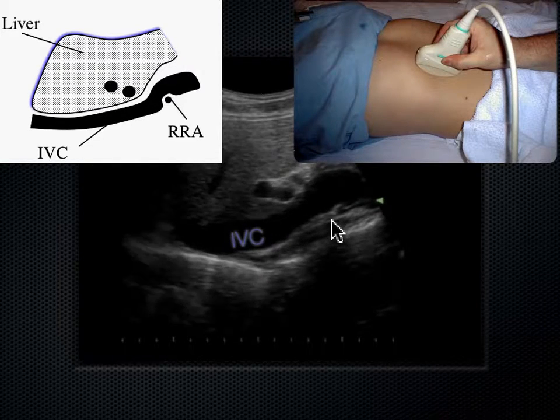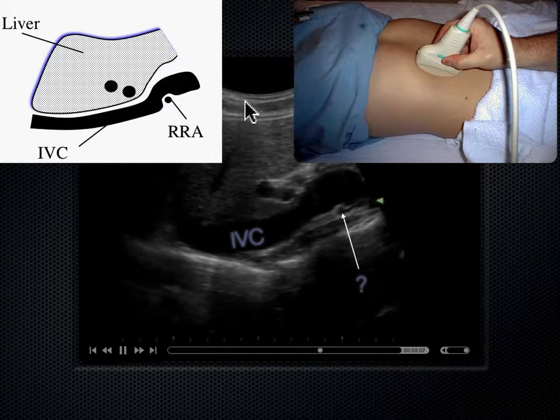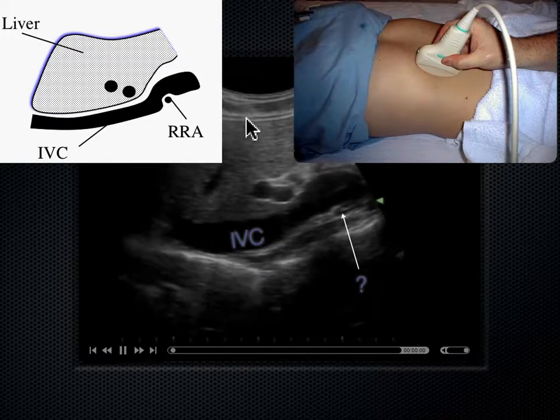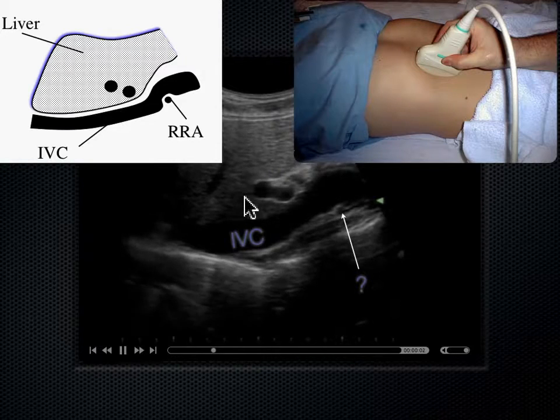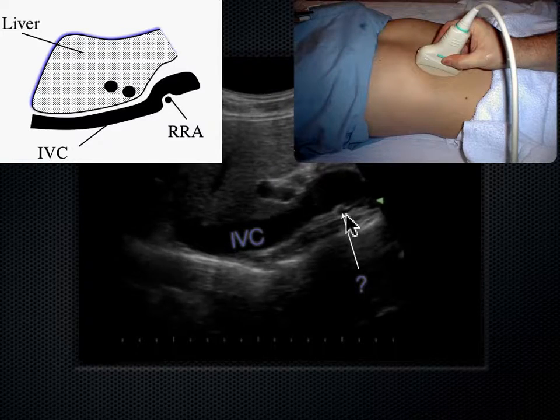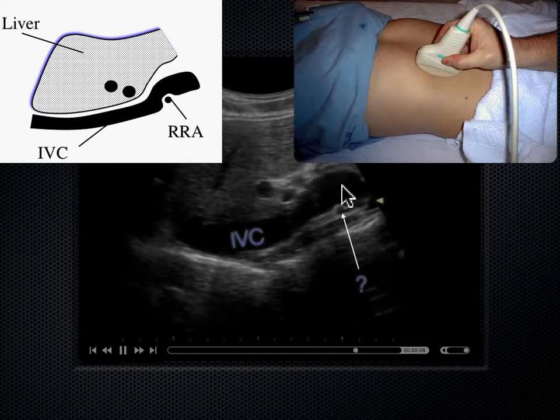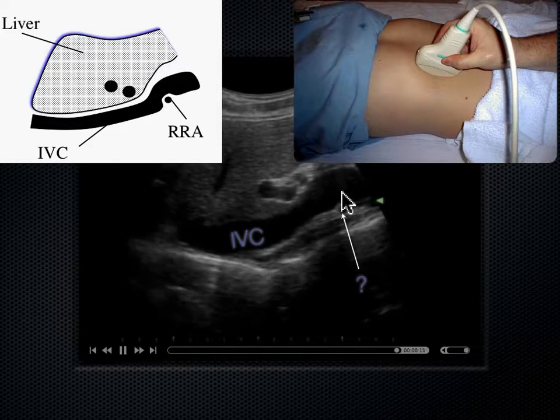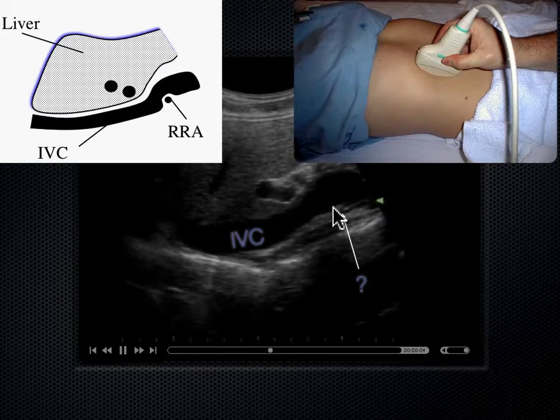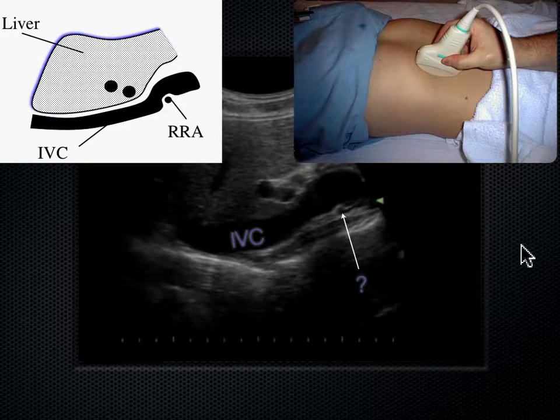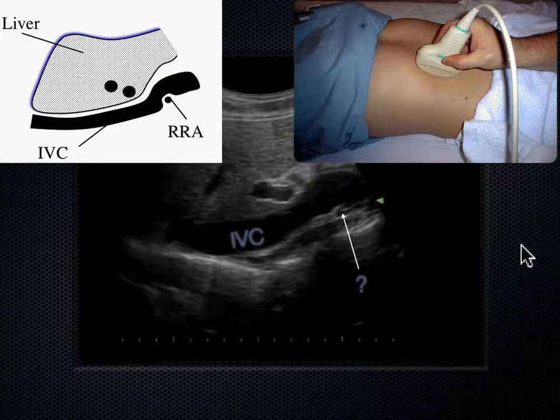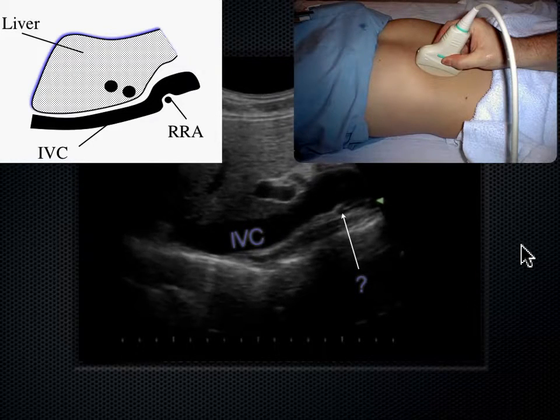If this is anterior where the probe is on the skin line, and the sound is going down posteriorly—this is posterior down here—what vessel lies posterior, or behind the IVC, yet perpendicular to it? The IVC is here in its long axis, but this vessel here is round, in its short axis. That's the right renal artery.